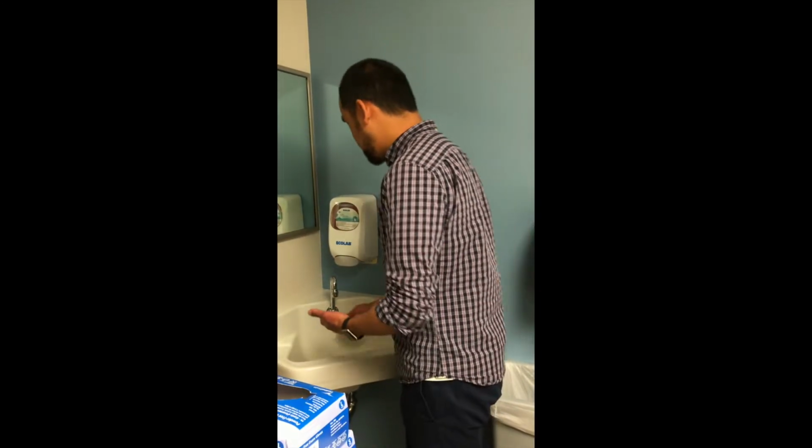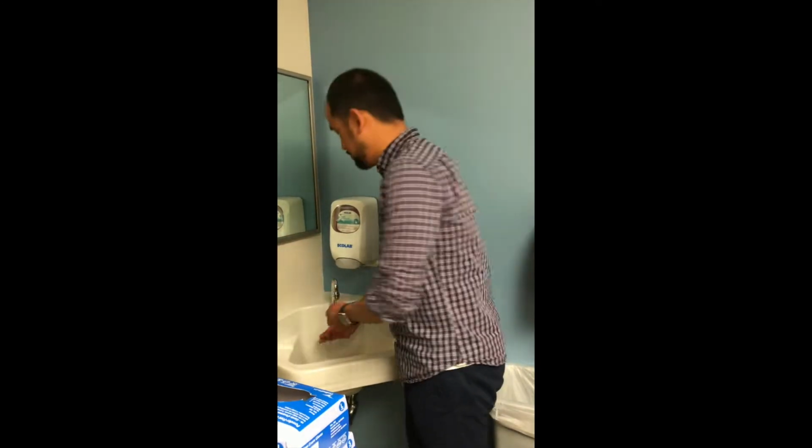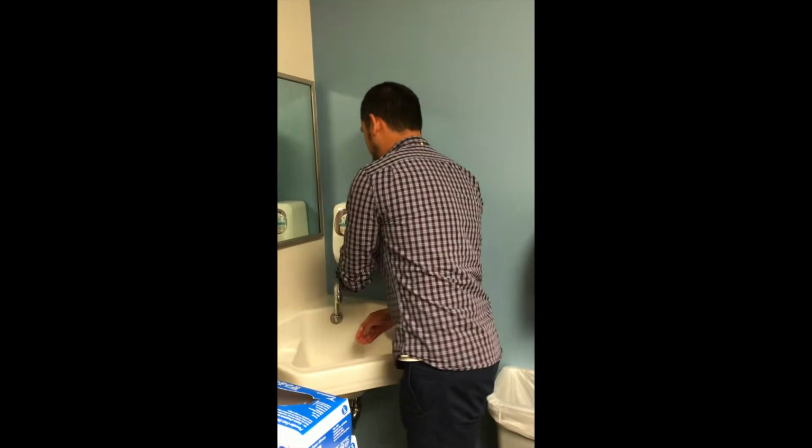So to start off, the first thing you need to do every time you prepare your injection is to wash your hands to minimize the risk of infection. Just get some regular soap and water and wash your hands. Now that I've washed my hands, we can go ahead and set up and prepare our injection.